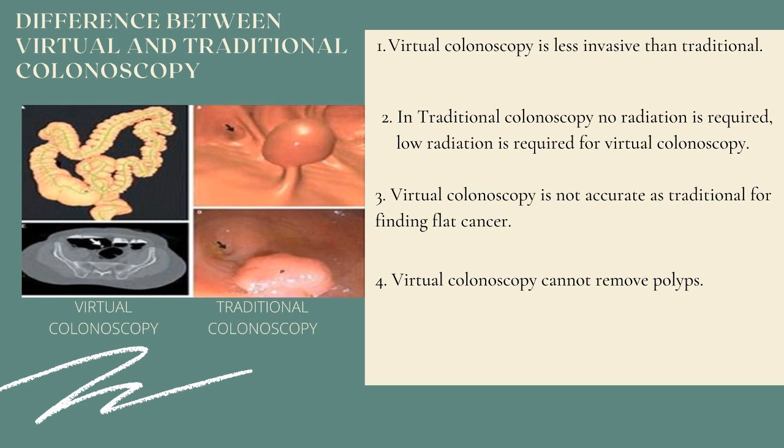Next, we are going to see the difference between virtual colonoscopy and normal colonoscopy. Virtual colonoscopy is less invasive and faster to perform than a traditional colonoscopy and does not require conscious sedation. In traditional colonoscopy, no radiation is required. A low dose of radiation is required in virtual colonoscopy. Virtual colonoscopy is not as accurate as traditional in finding flat cancers. Virtual colonoscopy cannot remove polyps.